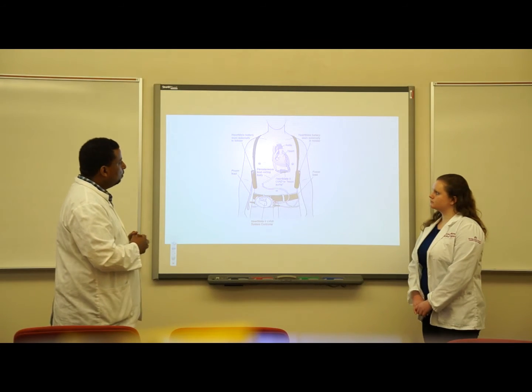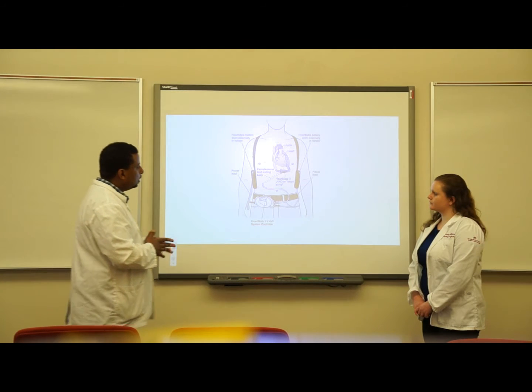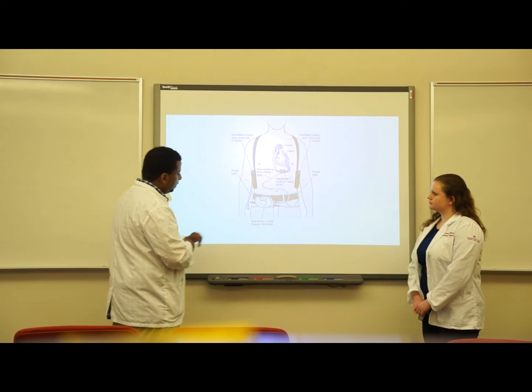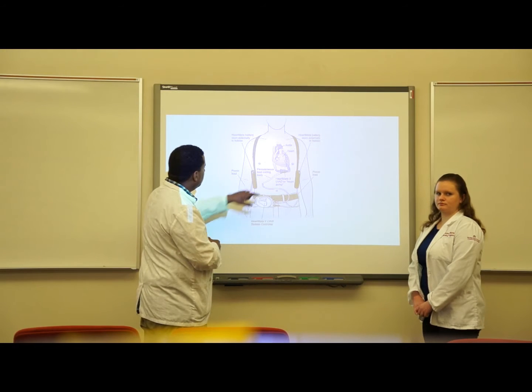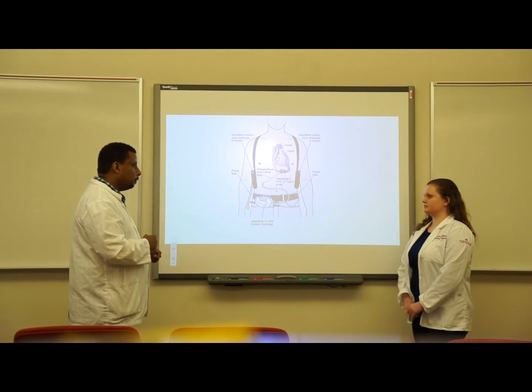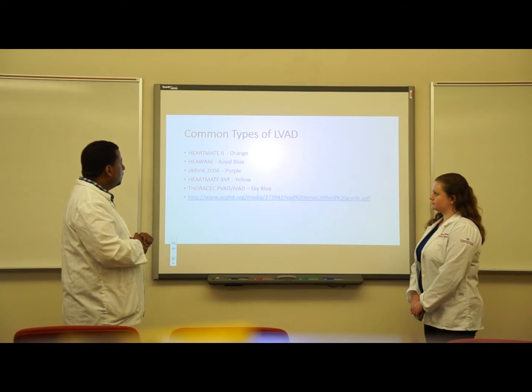All right, so this is another diagram. We looked at the video before, and then this outlines the various parts of the LVAD. This is a controller system. This is implanted. These are the batteries. But I think we have looked at a better video earlier, but this is another way of putting it.